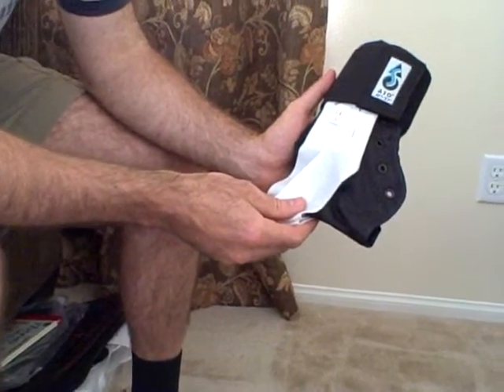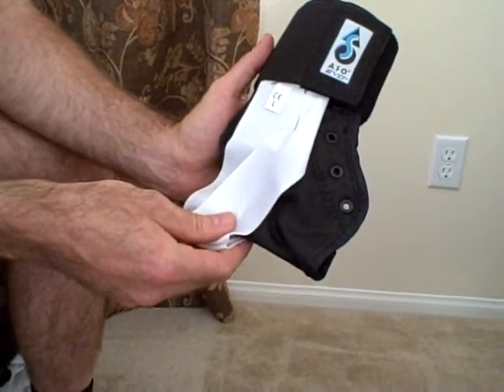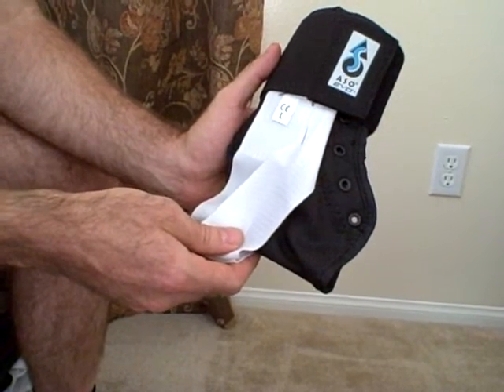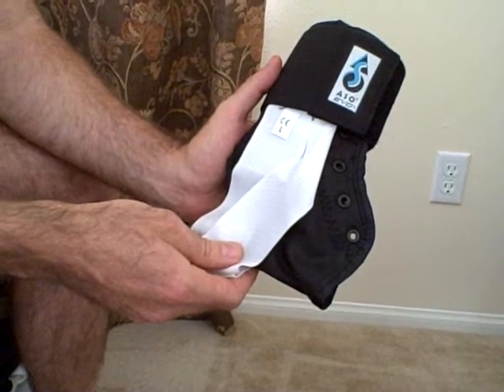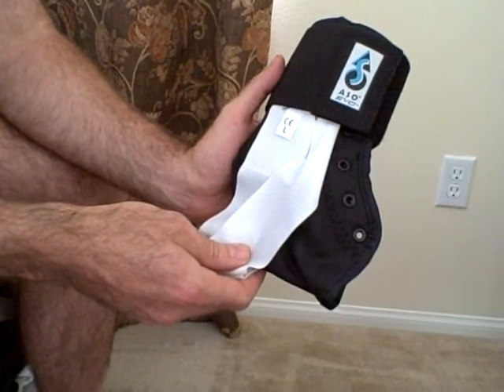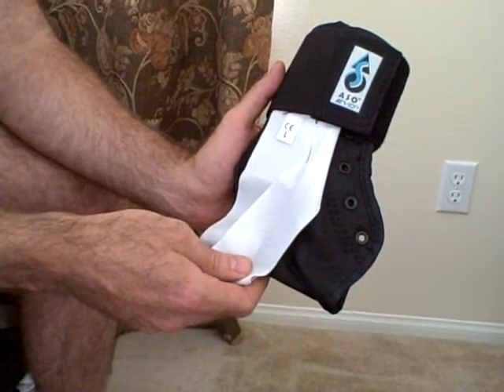This is the new ASO Evo Ankle Brace from MedSpec. It's a great improvement over the original standard ASO model, and here in front of me I have a demonstration model to show you some of the unique features. The brace itself comes in either black or white, but for demonstration purposes I have a brace with white straps to highlight some of the unique features.